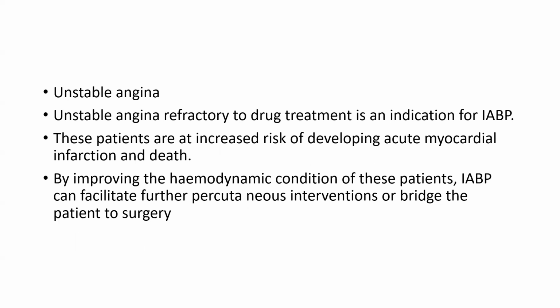Unstable angina refractory to drug treatment is an indication for IABP. These patients are at increased risk of developing acute myocardial infarction and death. So by improving the hemodynamic condition of these patients, IABP can facilitate further percutaneous intervention or bridge the patient to surgery.